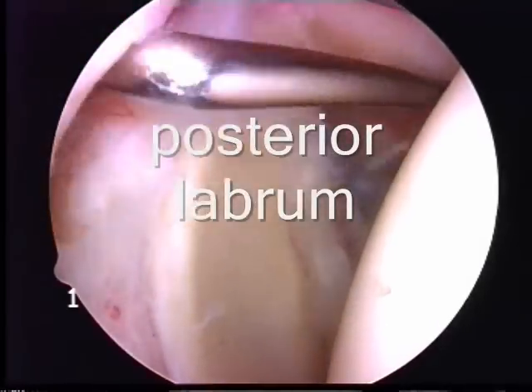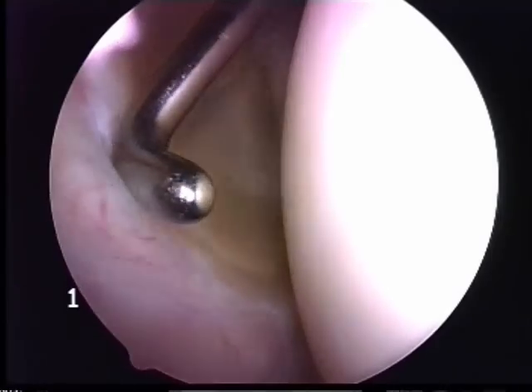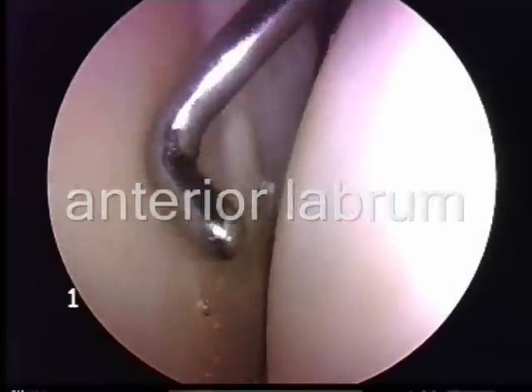Round to the back of the glenoid is the posterior labrum — the cartilage that helps hold the ball in place — and out to the front is the anterior labrum of the shoulder joint.